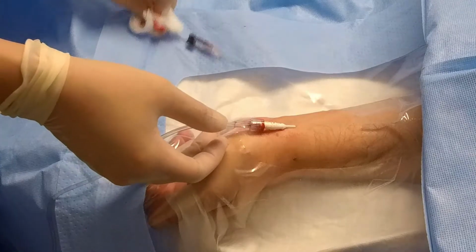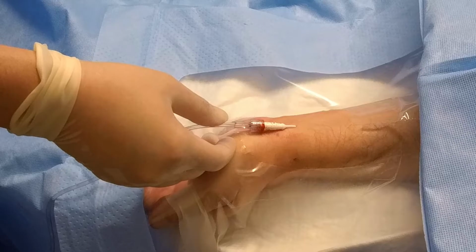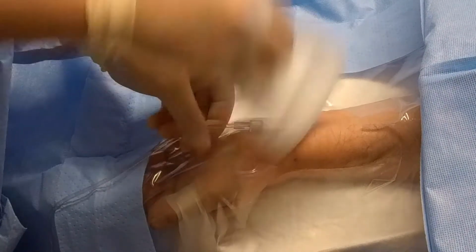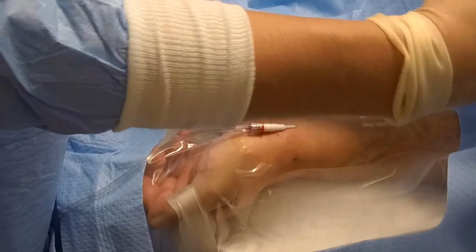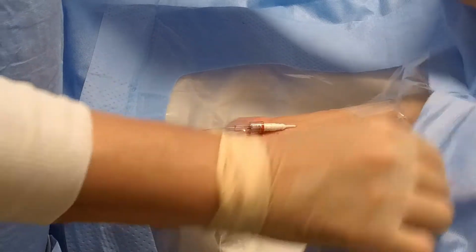No mess. So this drape, there's a breakaway. You want to tear this drape, this breakaway.